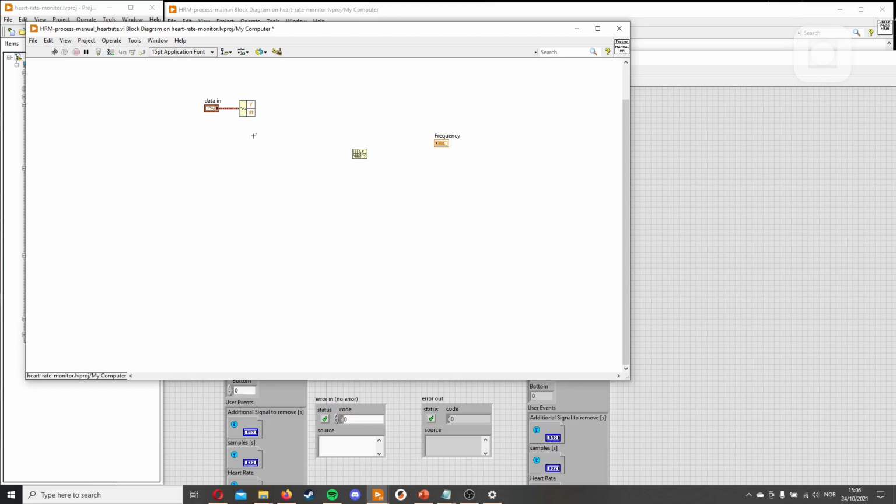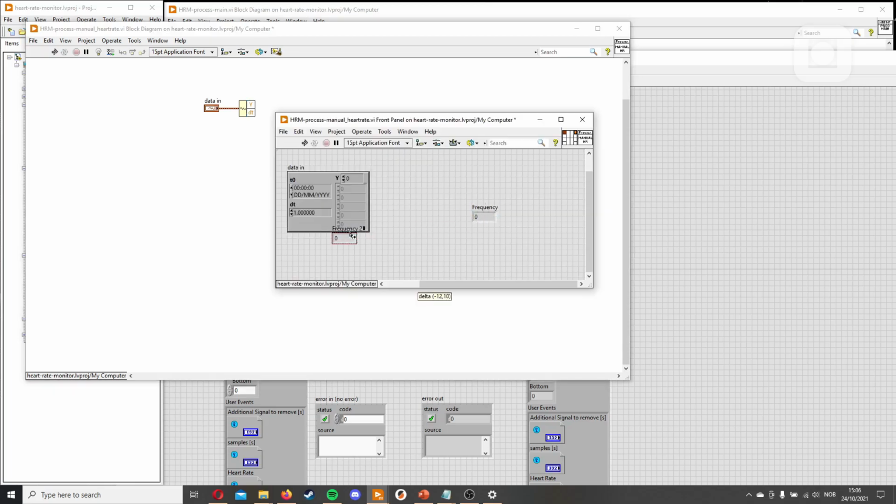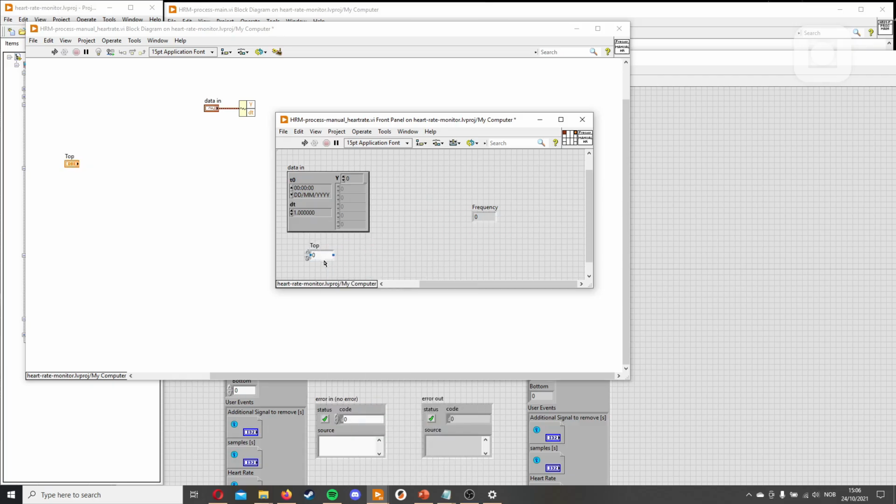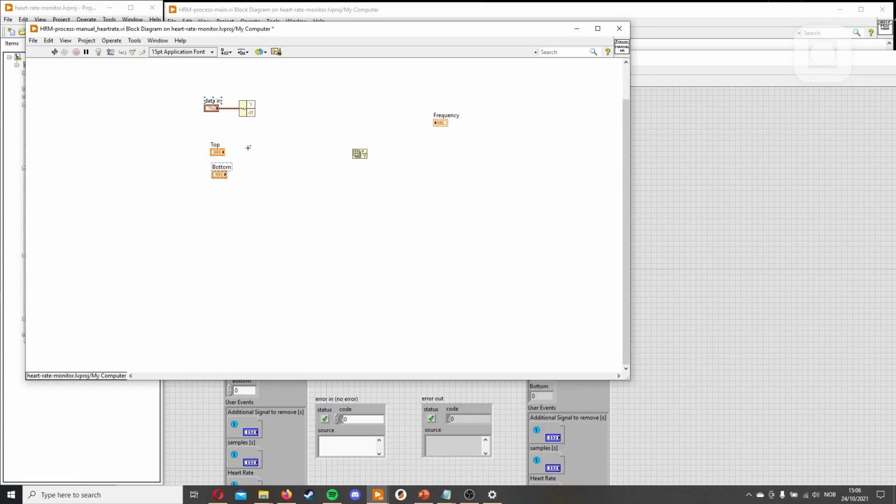So what we'll do is to use the data in with our top and bottom values to the frequency. So we'll need to add the top and bottom values too. Top, change to control, and then bottom. From these inputs, we will get the frequency out.